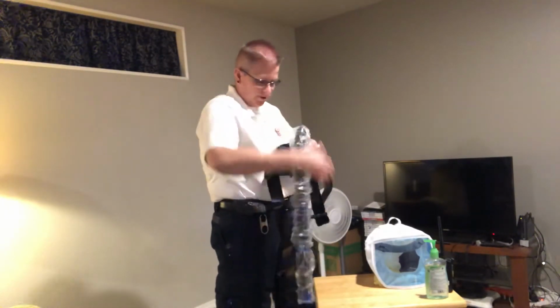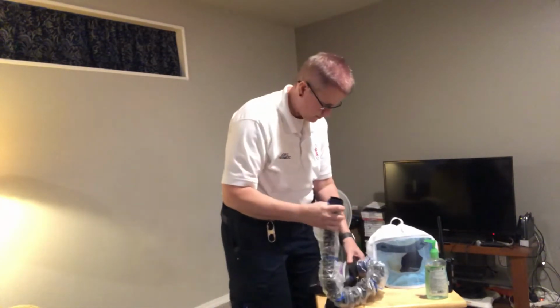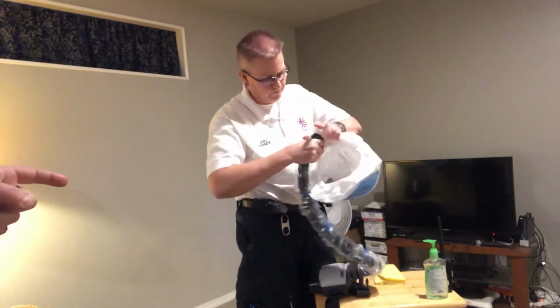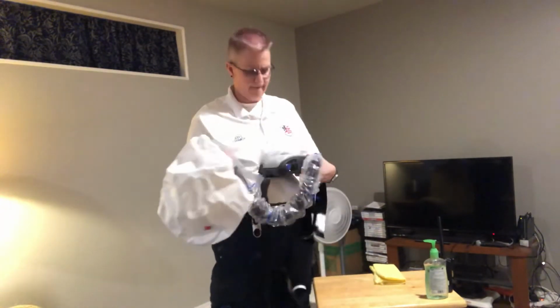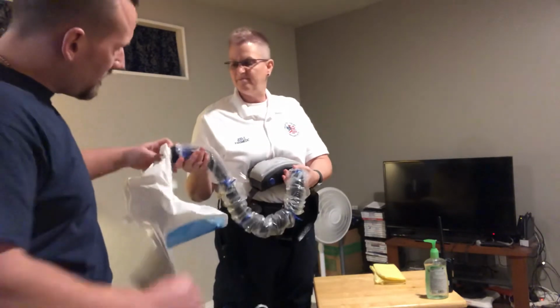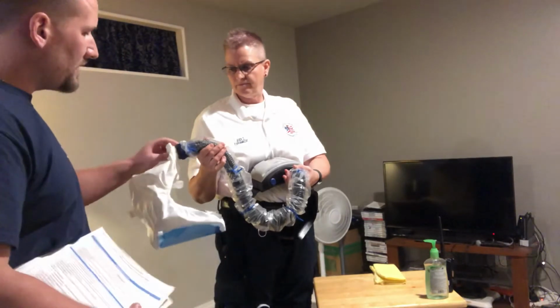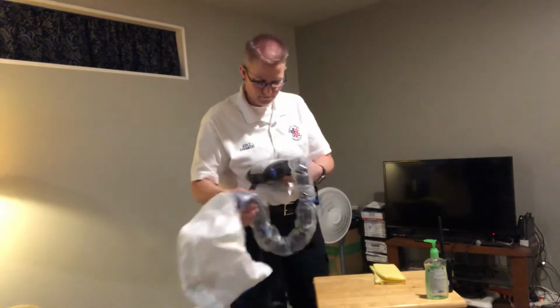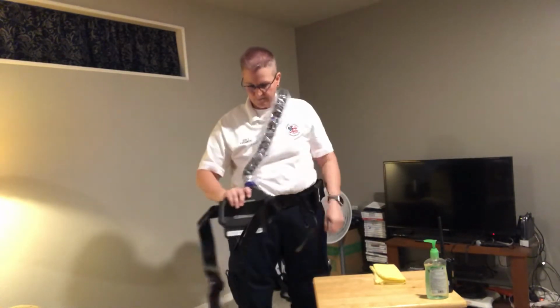So anyway, right now she's going to connect the hose. She's going to connect the hose both to the PAPR unit itself and to the rear of the hood. So if you can just kind of show where that, yep. And I don't know if you could hear that click, but there is an audible click when you're actually sealed onto the hood here. So basically the plug-in's right at the top of the hood. Okay, if it's loose or anything like that, just feel it, pull on it gently. Make sure that it's not going to be popping off or anything like that, mid-contact with a COVID patient. Let's avoid that.